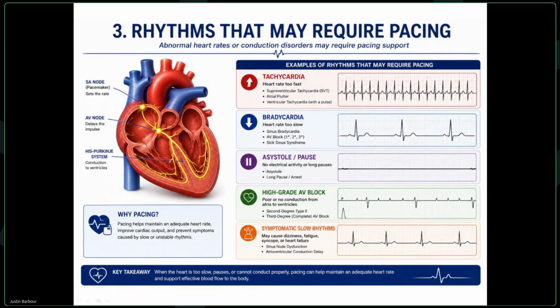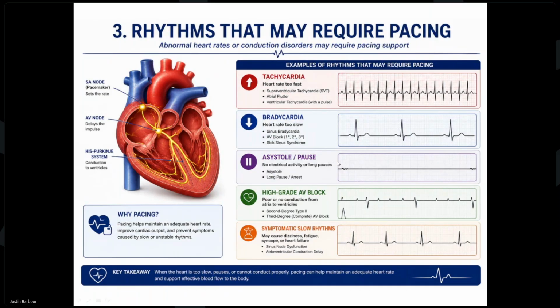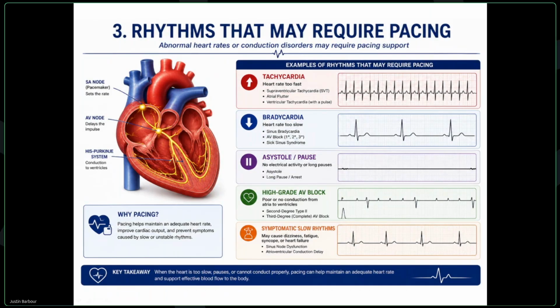The thing about an asystole is we can actually pace the heart. Somebody that has, let's say, brain damage, or cardiac damage, maybe with the nerves that wrap around the heart, you can get an asystole and the heart no longer wants to beat. But if there is treatment down the road, let's say a heart transplant or, God forbid, some other type of surgery, maybe even if this patient was going to be an organ donor, what they will do on an asystole is they will pace the heart to maintain circulation.